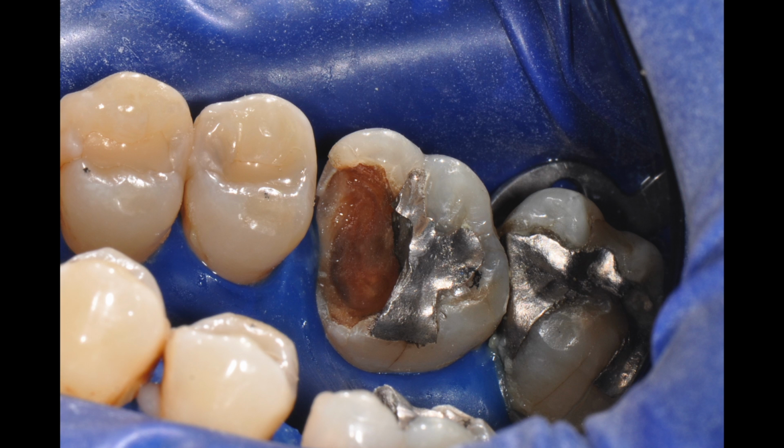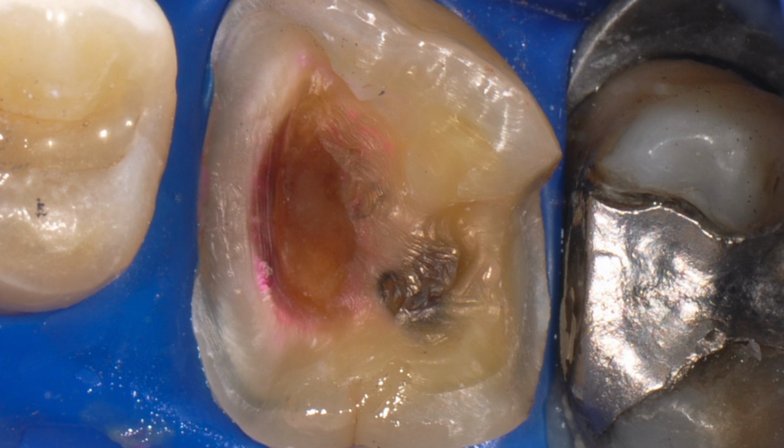Following our restorative analysis, anesthesia is achieved and the rubber dam is placed for isolation and patient comfort. The peripheral decay and all existing restorative materials are removed. The deep decay adjacent to the pulp must not be removed in order to avoid pulpal exposure. Caries detection dye is used to aid in the complete removal of caries in the peripheral areas needed to develop a seal around the deep caries. In this slide, you can see the deep caries dyed light pink, but the dentin around the deep decay is not stained, indicating healthy bondable dentin.